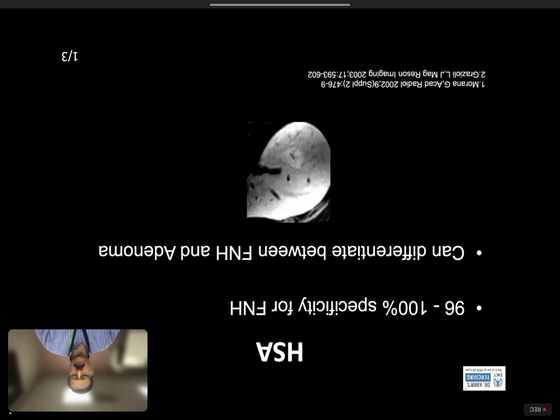So till delayed phase, till 10 minute, adenomas and FNH, as far as just contrast enhancement is concerned, there will be arterial enhancement and no washout. So now you are sure that this is adenoma or FNH, and it is not a flash hemangioma because of other features which I told you, like high T2 value, restricted diffusion, etc. Now, then you do a hepatobiliary phase to discriminate between the two.